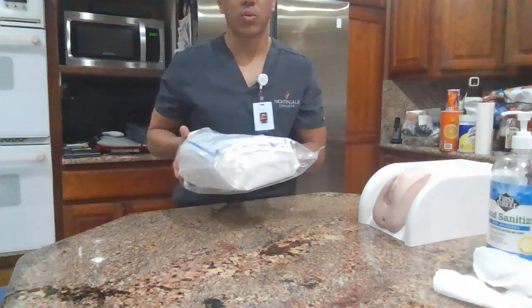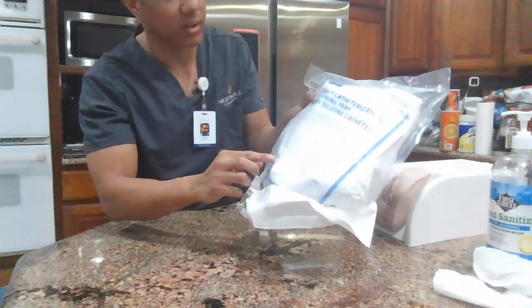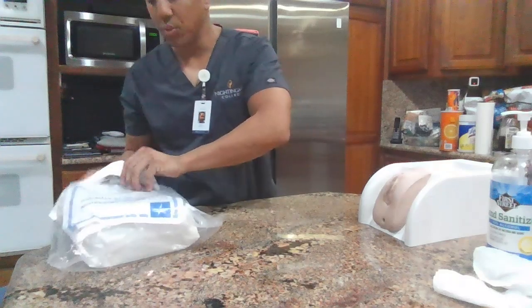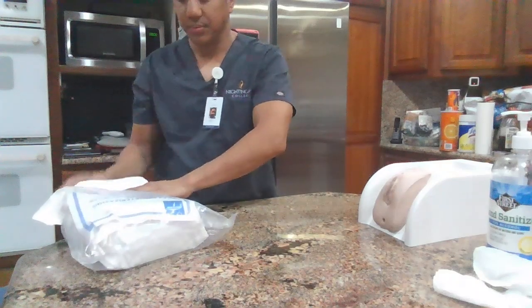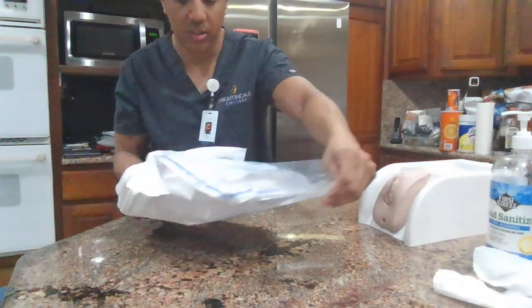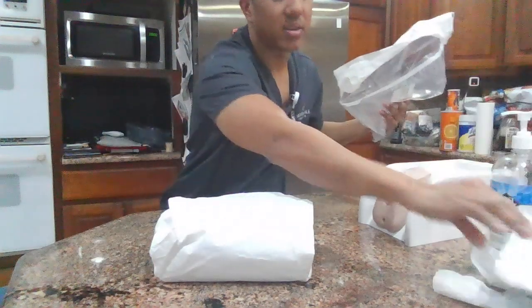So I'm going to show that I have the right Foley catheter kit, and this is a 14 French Foley catheter with a 10 milliliter balloon. I'm going to carefully take the kit out of the box like this and place the kit between her legs. I'm going to use the outer part of the bag as a garbage disposal.